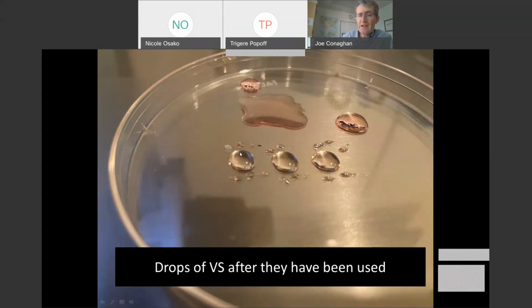That's because when I put the eggs in this first drop of vitrification solution, I emptied out my pipette several times and went back in and refilled it so that I'm removing any trace of the equilibration solution that might have got carried over. And I do that in the second drop. I empty out my pipette and refill it here, and even in the third drop, so that the eggs in this last drop right here, there should be no trace of that equilibration solution that's come all the way through to here. Right? So it looks kind of messy and ugly here right at the end, but you can really tell just by looking at this that I really went to a lot of trouble to wash out my pipette and rinse it out as I was moving my eggs across to the last vitrification drop.